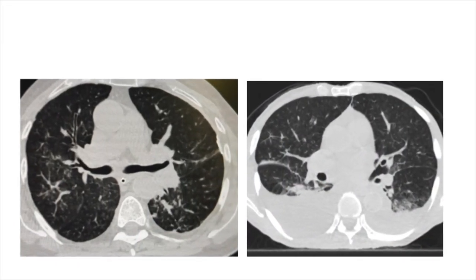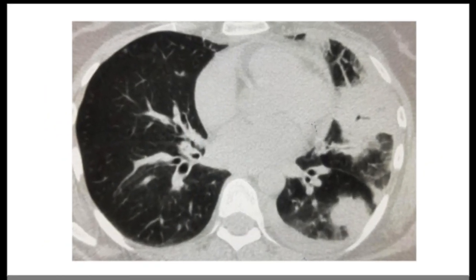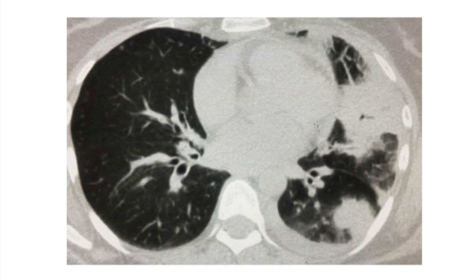This patient of swine flu, for example, has centrilobular nodules, a lot of pleural effusion, which is conspicuous by its absence in COVID-19. And also we find consolidation, which is not peripheral and involving one lung. And so it is unlikely to be COVID. And so with this, I come to the end of my talk.